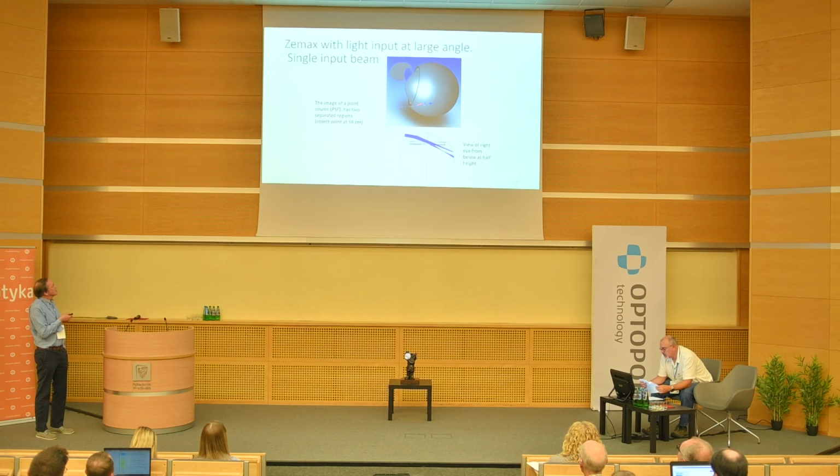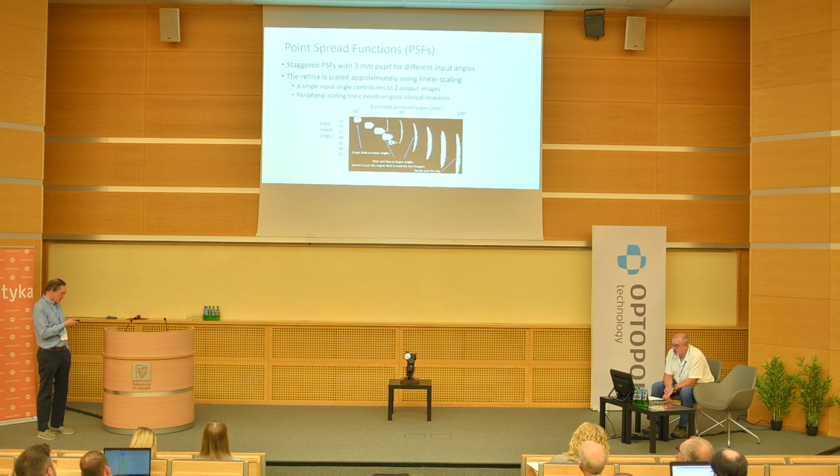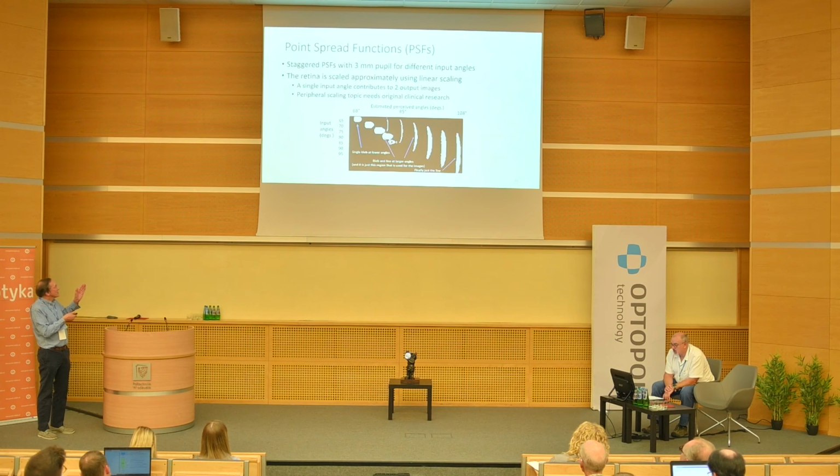Even just looking at the size, this is kind of a near object. This is physically what it looks like on the side of the eye with an average retinal diameter, if you like. It looks huge, doesn't it? But you definitely get these two things, and in principle can see two images. The point spread function itself looks like this. You start out with a blob at a certain angle, and as it increases, you get the blob on the line, and ultimately you kind of average it out. And then eventually you end up just with a line in the far periphery as the angle increases.